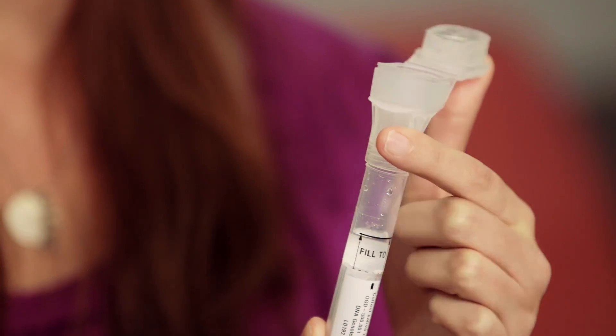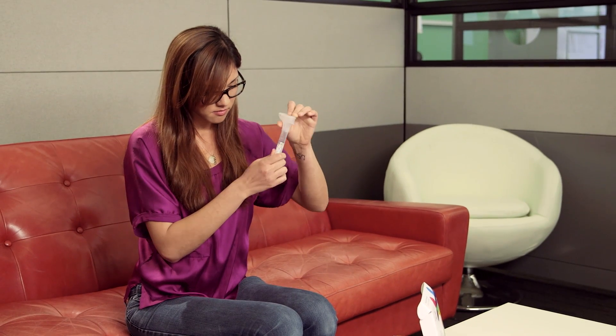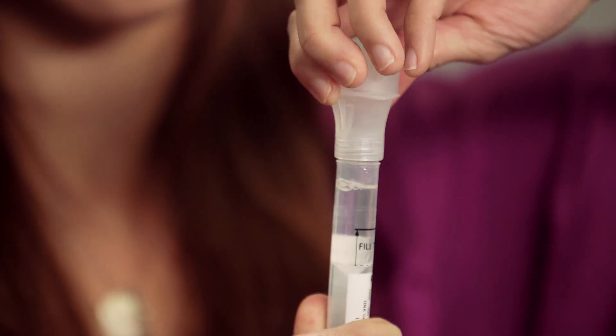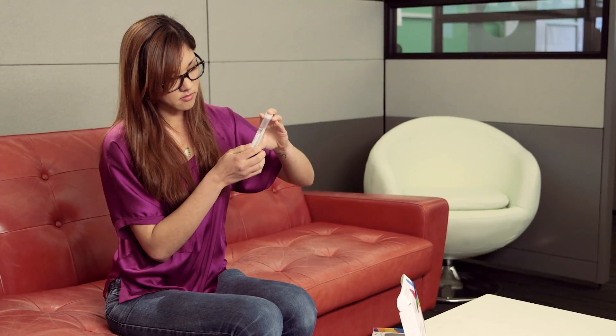To release the buffer solution, fold the funnel lid over and close it slowly until you hear a snap. Make sure that you're holding the tube upright to prevent spills and that the full contents of the funnel lid are released into the tube. Then carefully unscrew the funnel lid and replace it with the tube cap, making sure it's on tight. Gently shake the tube to combine your saliva sample with the buffer. The buffer will preserve and stabilize your DNA for up to six months and at a wide range of temperatures, so if your sample travels through a heat wave or a polar vortex, it'll remain safe in the mail.